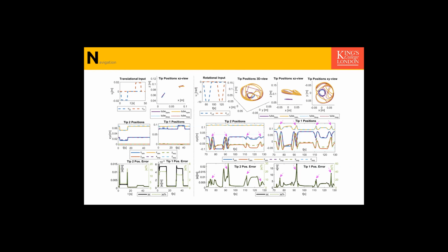I see. And what is the computation time for one cycle for 2 tubes right now? It really depends on if it's snapping, post-snapping, or pre-snapping. Give me a range. What's the minimum computation time and the maximum computation time per result? In the worst case, the simulations were twice faster than real experiments. But the best case, they were like 100 times or up to like 500 times faster if it was only a simple translation. I see.